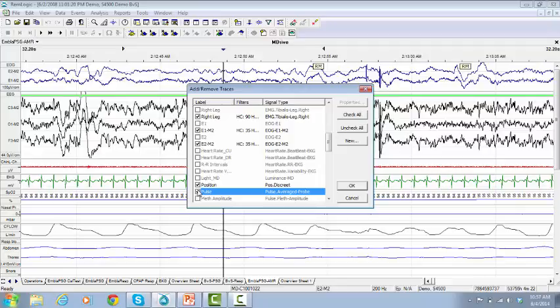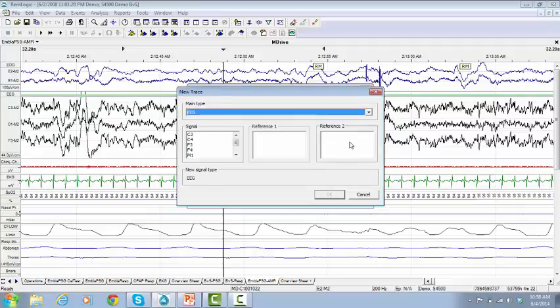If you want to create new traces which are not already existing in the traces list, click on New. The New Trace window will pop up.